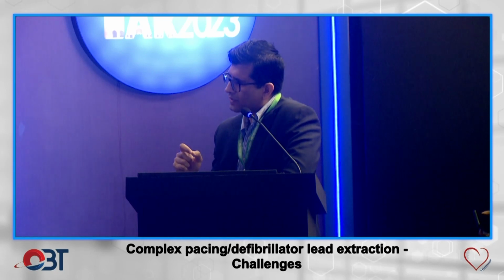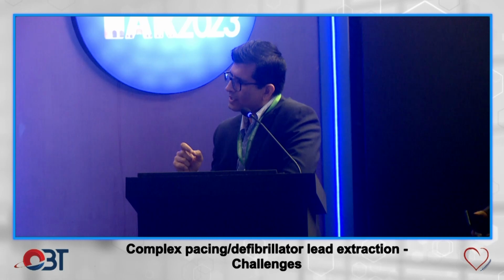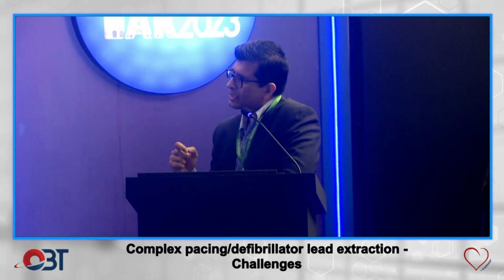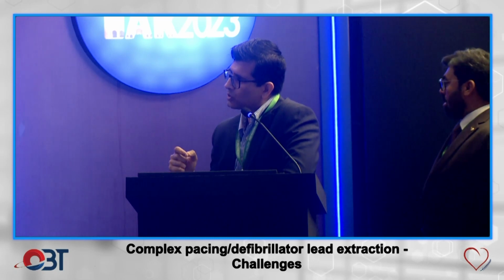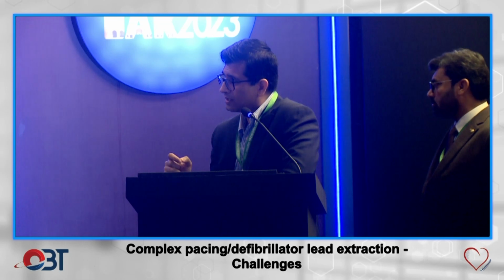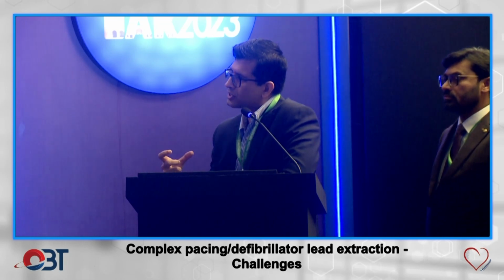I don't have the exact figure, but what I can tell you is that if you are not properly trained, it is a very dangerous tool. There is a high risk of perforation, and a simple movement like pushing the catheter or orienting the catheter in the wrong direction has a high risk of causing perforation. That is the reason we need to do this procedure in the hybrid lab. One needs to be properly trained, and these are the maneuvers with which the overall complication rate can be reduced.